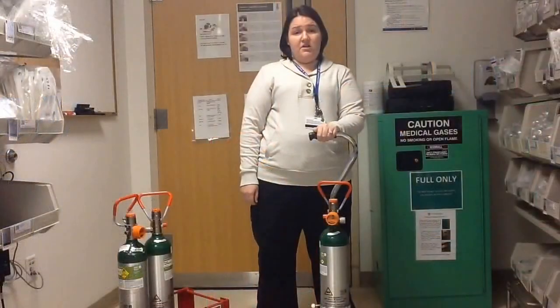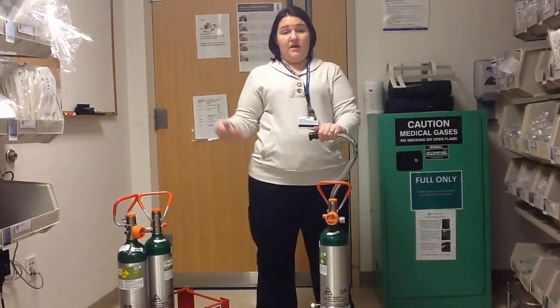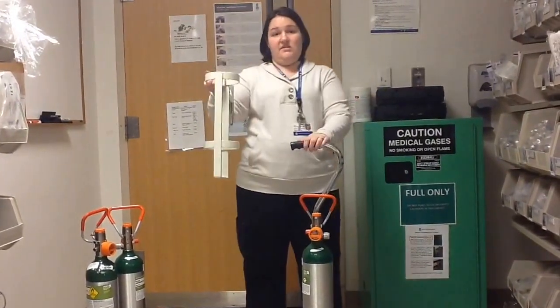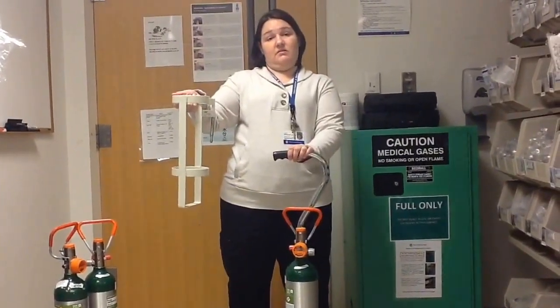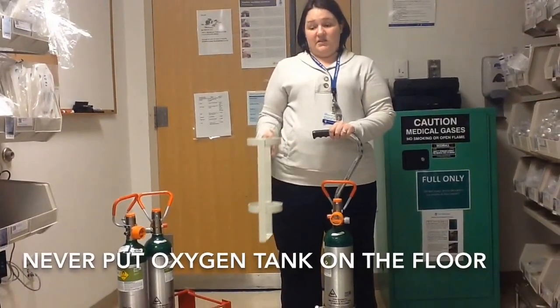When transporting with an oxygen tank, you want to make sure that you either have it in a carrier individually like this, or the carrier underneath the patient's bed, or in one of these carriers attached securely to the patient's bed. You should never put an oxygen tank on the floor where it's unsecured. Always have it secured in some type of carrier.